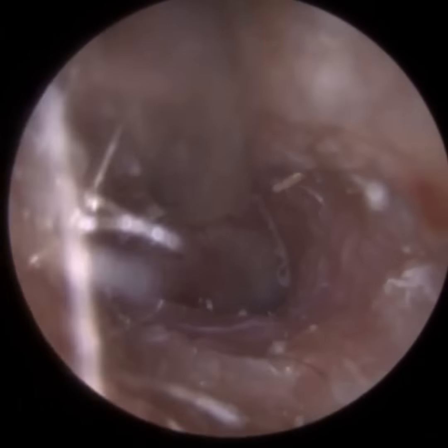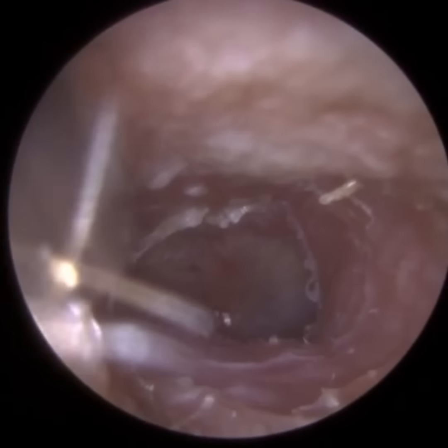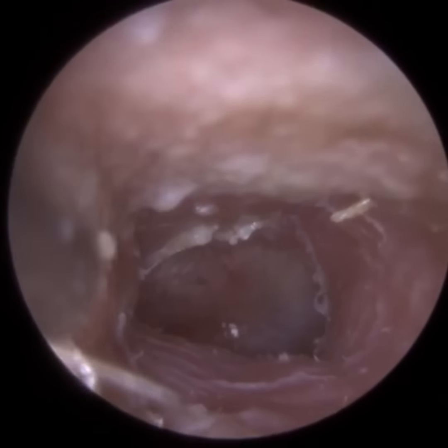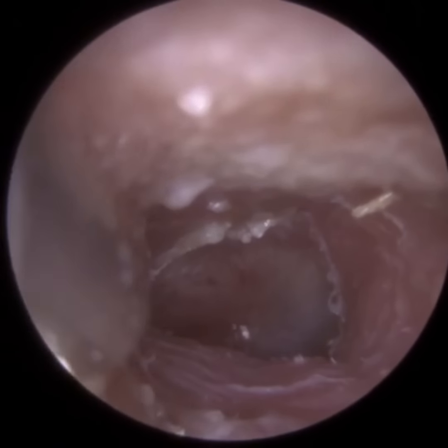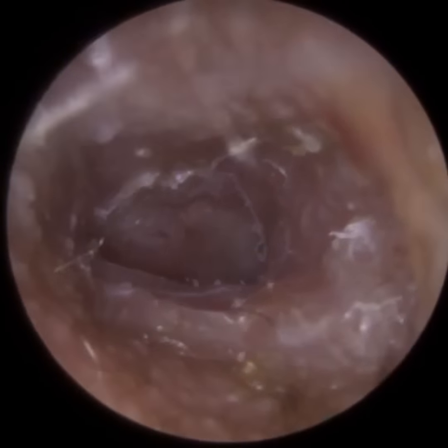Well, I hope you enjoyed that video, guys. It was interesting and it gives you a perspective of what's going on with the keratosis obturans, because you've got a good view here of how it widens the bony part of the ear canal and then you get swelling that engulfs it. And also because it's infected as well. You can see all the colour of the ear canal is quite spongy, it's swollen and it's inflamed.